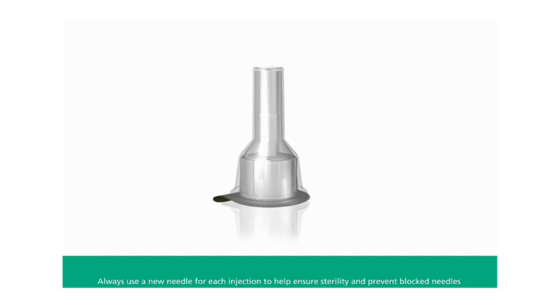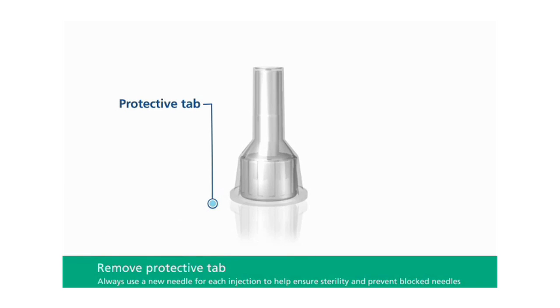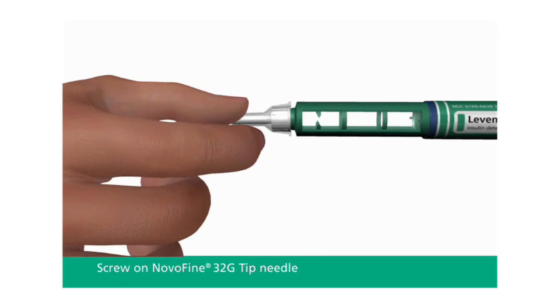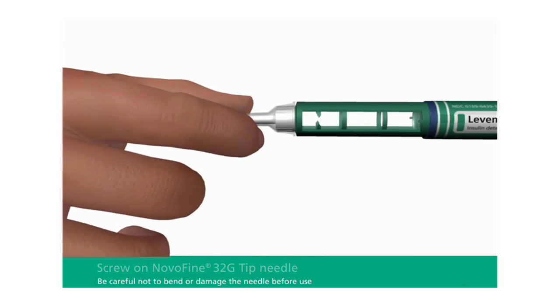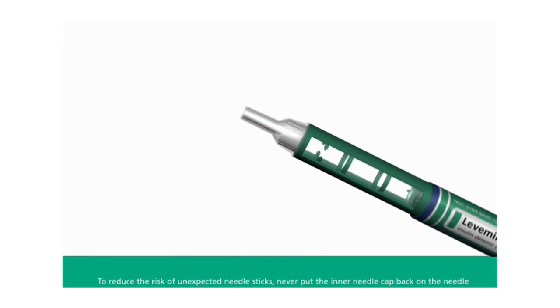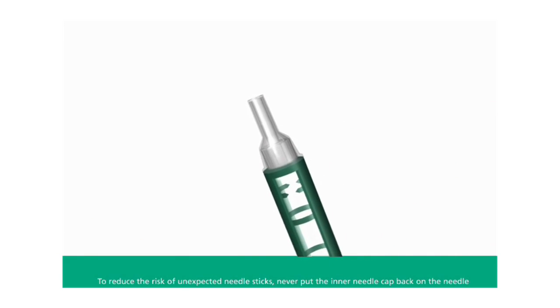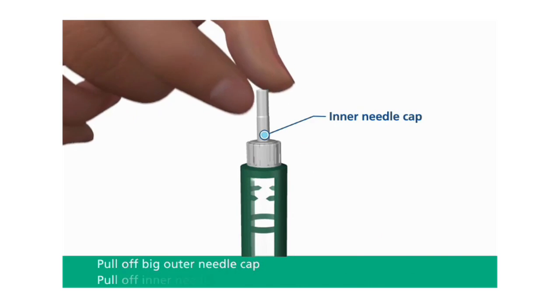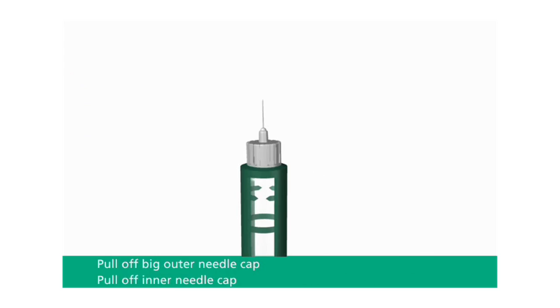The next step is to attach the needle. To do so, you must first remove the protective tab from the disposable needle. Then screw the needle tightly onto your Levemir FlexPen. It is important that the needle is put on straight. Never place a disposable needle on your Levemir FlexPen until you are ready to take your injection. Pull off the big outer needle cap, then pull off the inner needle cap and throw it away.